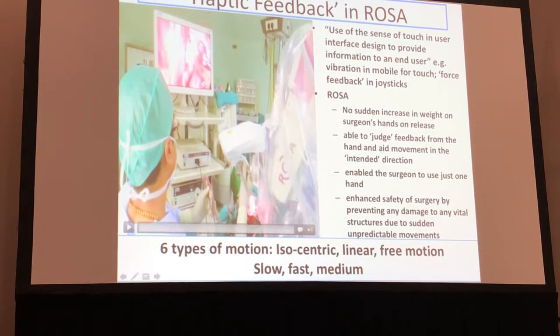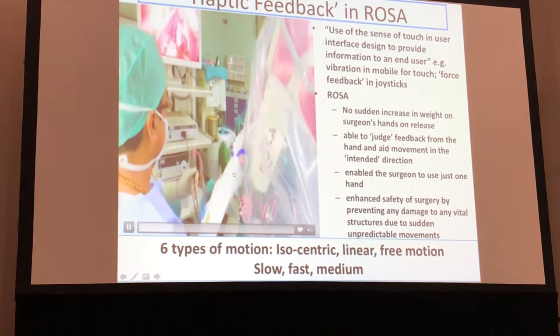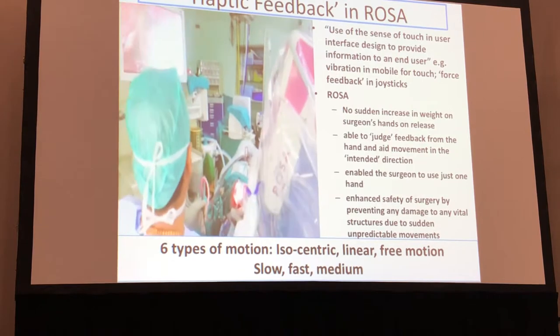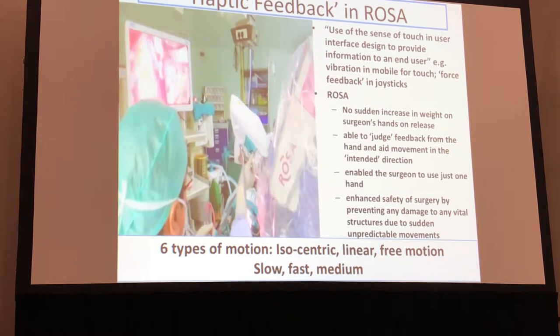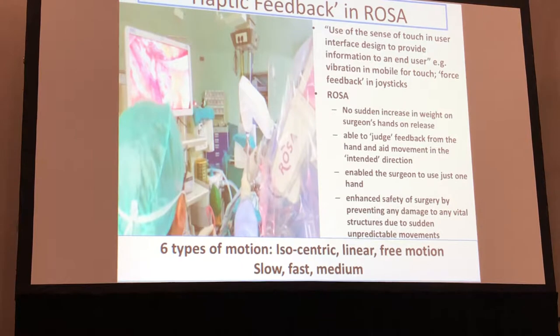So this is how I use it. I attach it to an endoscope holder, and you can see I'm in the interhemispheric area performing a hemispherotomy. And it gives me a very smooth and stable workflow so that both my hands are free. And when I move it, it goes along with the intended direction. So that's the reason I call it a haptic feedback.